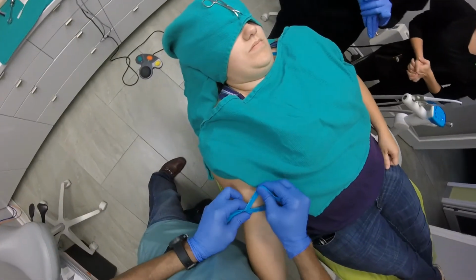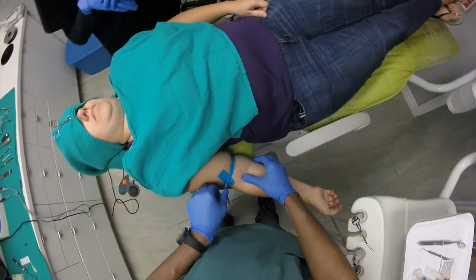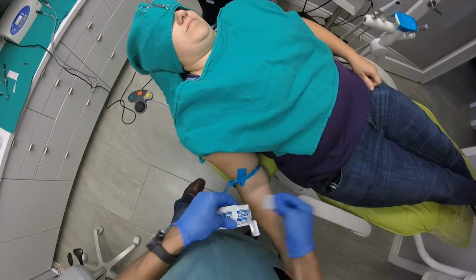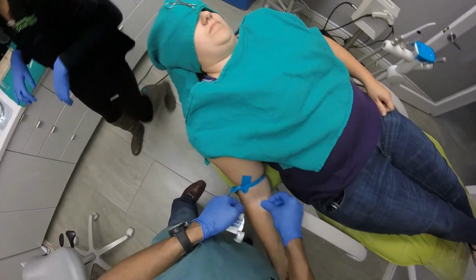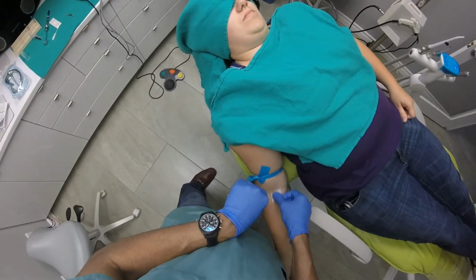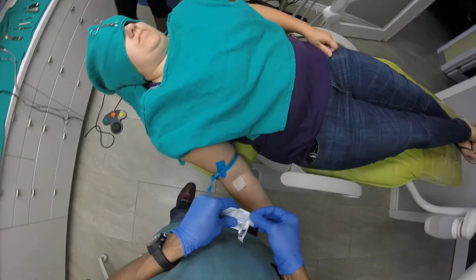So in this video, you can see we're taking the kit apart. These are pre-assembled kits that we usually keep in our office, and namely inside the bag you have the tourniquet, the alcohol, the vacutainer holder, the vacutainer holder needle, which I'm assembling right now, and there are 2 vacutainers that we keep inside these kits along with a bandage, and we're usually just opening the package up and getting the bandage ready.